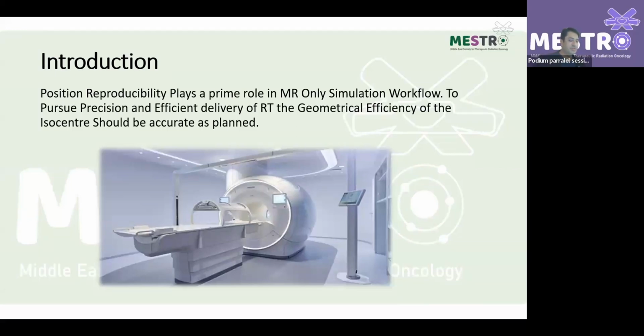The position reproducibility plays a prime role in MR only simulation workflow for the precision and efficiency of the delivery of the radiotherapy. As you know, everyone, the geometric accuracy of the isocenter should be accurate as planned.